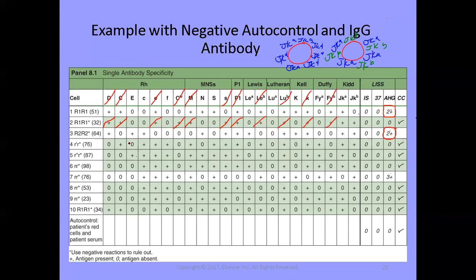Negative here, eliminate positive over here. Now here's the thing. If I have previously eliminated an antigen, I don't have to re-eliminate it. It's gone. I don't even need to look at it. So I just want to look at things that are left. I can't do anything with big E. It's not there. Can I eliminate little c? Dun, dun, dun, dun, the million-dollar question. If I'm considering dosage, no, because big C is there. Okay? This was already eliminated. I can get rid of the F, that compound antigen.